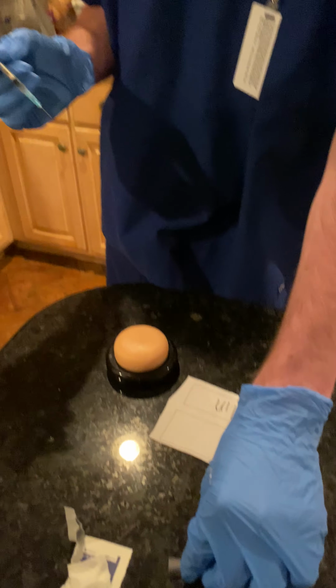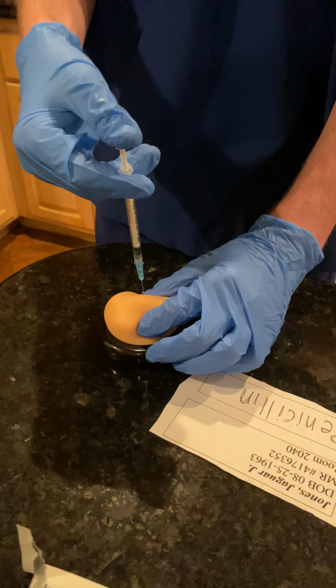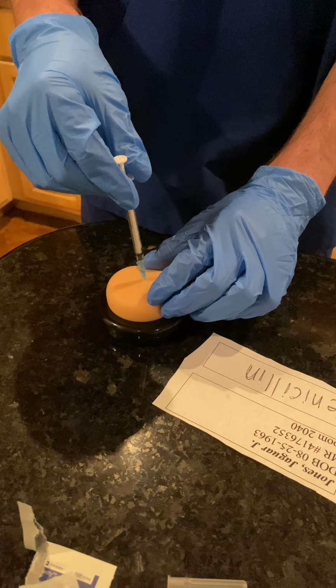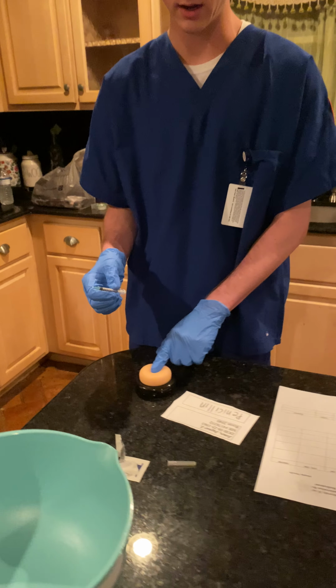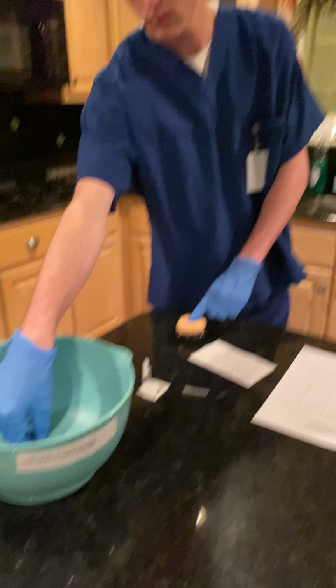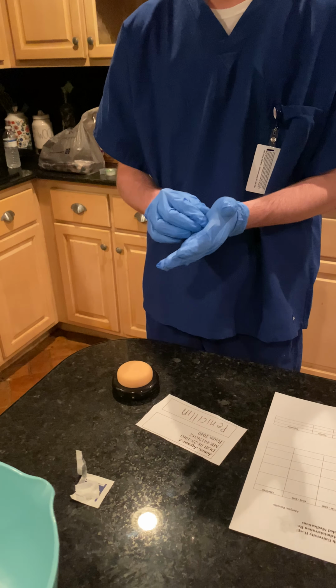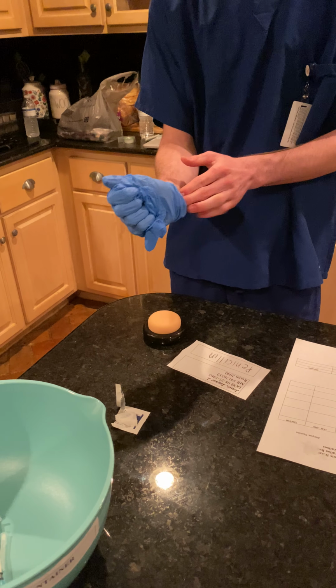And when I'm giving a subcutaneous injection, I will pinch the skin, inject, and then apply gentle pressure to the area that I just injected. I will dispose of the syringe and the cap in the sharps container and take off my clean gloves.